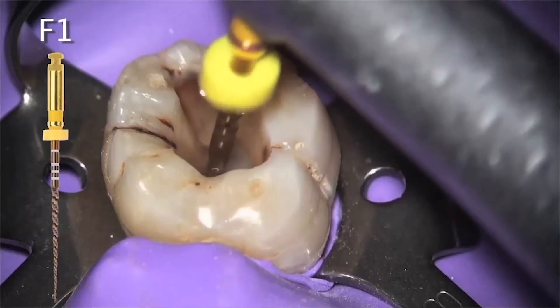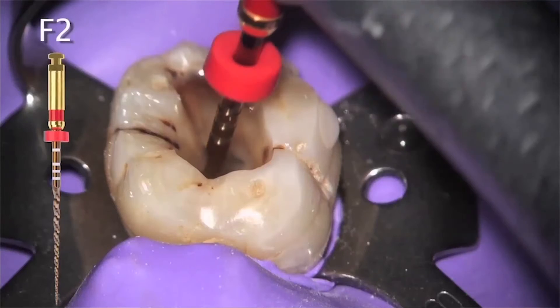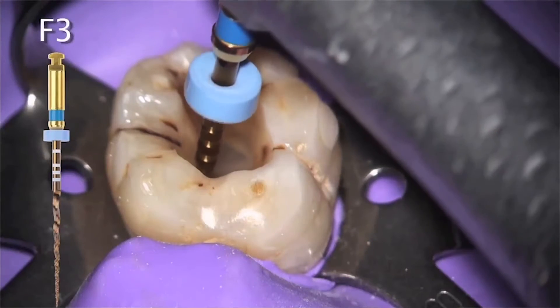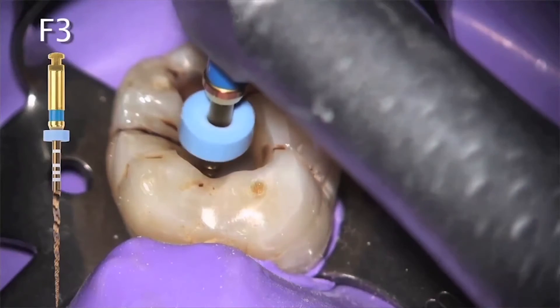Those ideas included early coronal enlargement, which was in fact the first description of what we know now as a crown-down technique. Dr. Schilder also advocated passive apical instrumentation, meaning that the file should never be forced to progress apically. This led us to develop an instrument that would work on the outstroke as opposed to being required to do its work by pressing it and often forcing it into the canal space.